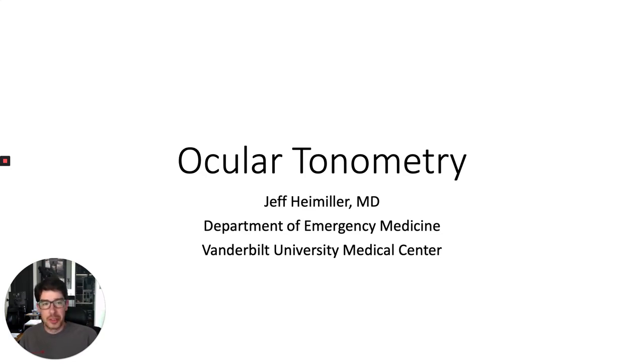We're going to learn the skill of measuring intraocular pressure, also called ocular tonometry. It is a necessary skill for the correct management of emergency ophthalmology conditions and must be mastered by emergency physicians.